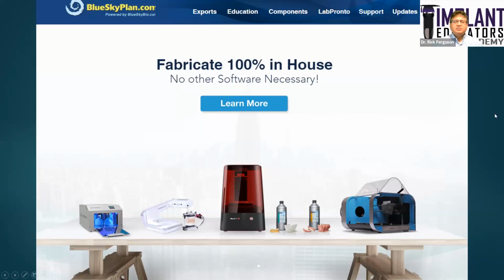So that brings us to what we are going to produce with these different printers. And of course, as I said, BlueSkyPlan is the backbone for what we do in digital dentistry, in our practice and in our courses as well. You can see some of the products here that Blue Sky has sold over the years. This is actually a current image from the Blue Sky website, but some of these products they don't sell anymore. I don't think they sell the Shining lab scanner anymore, or the Robox, of course, that's the old FDM printer, or the Moonray S.